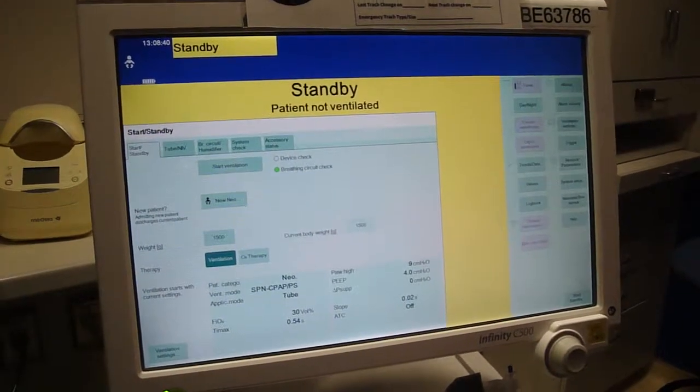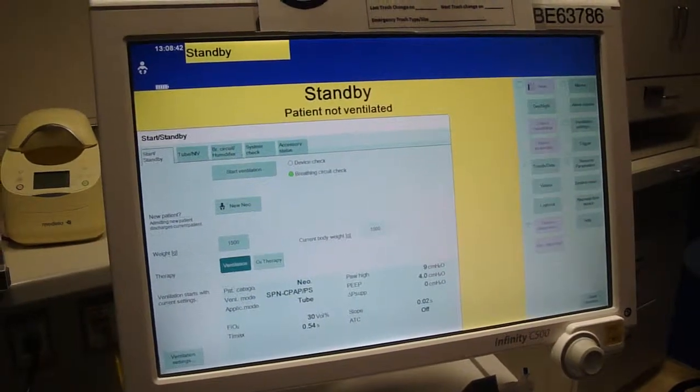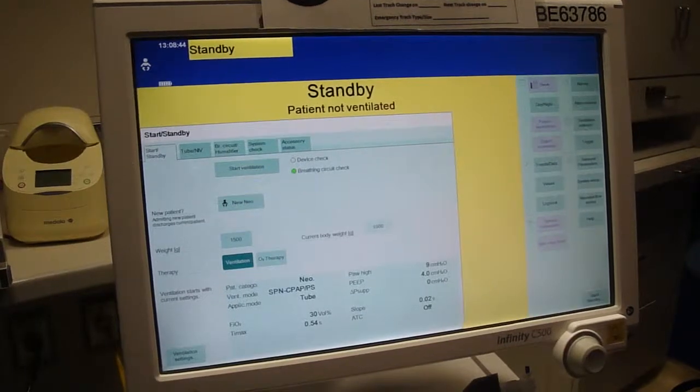This is going to be a video recording of how to set up and calibrate the Flexi-Trunk for non-invasive ventilation.